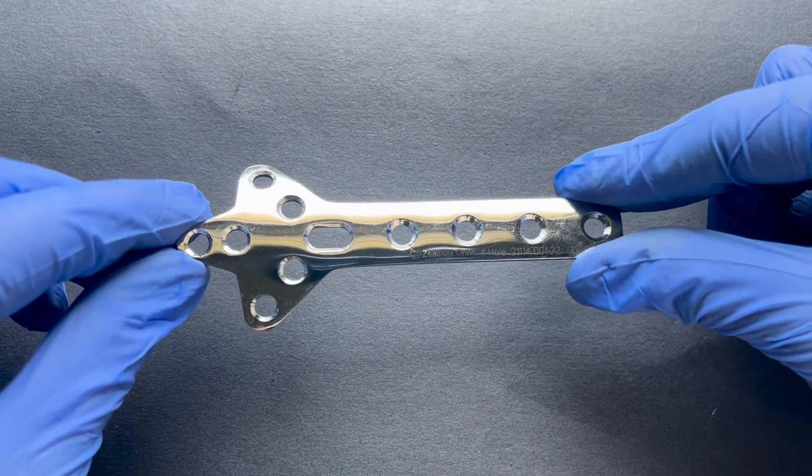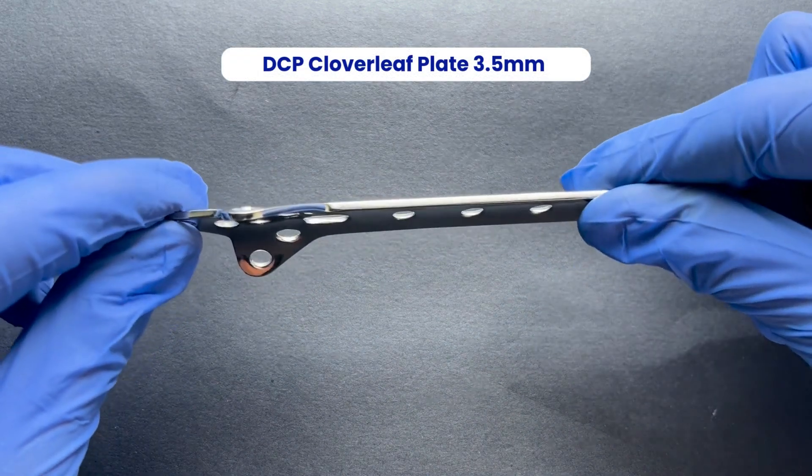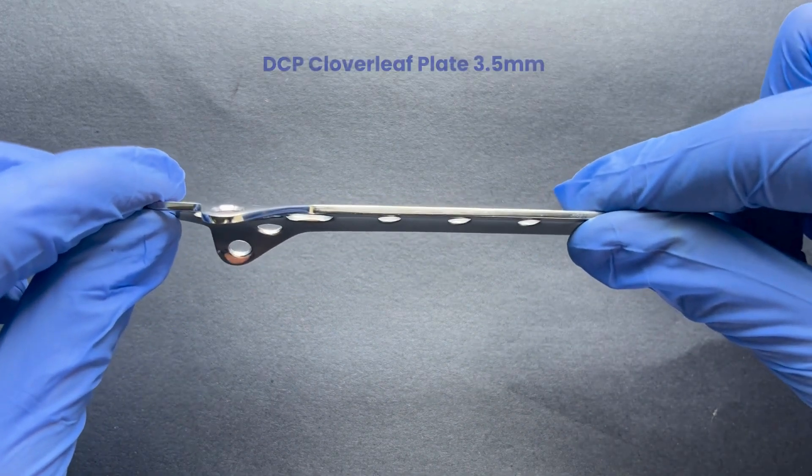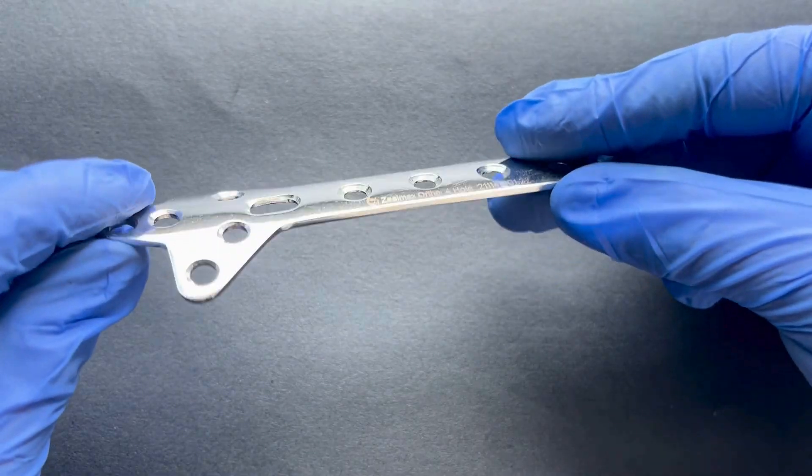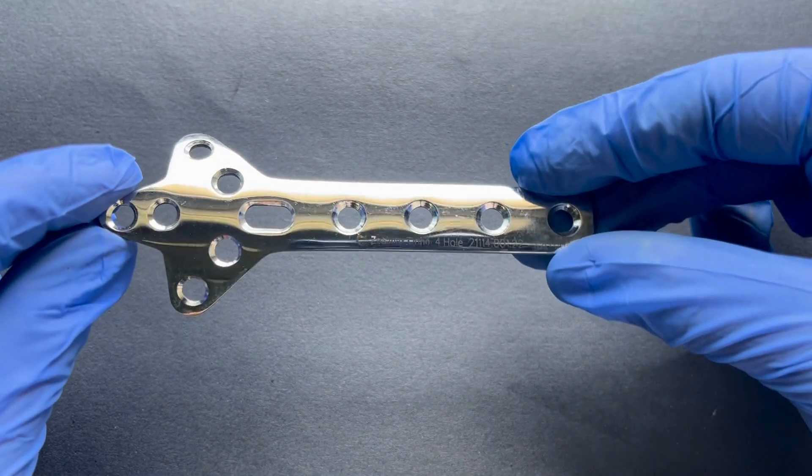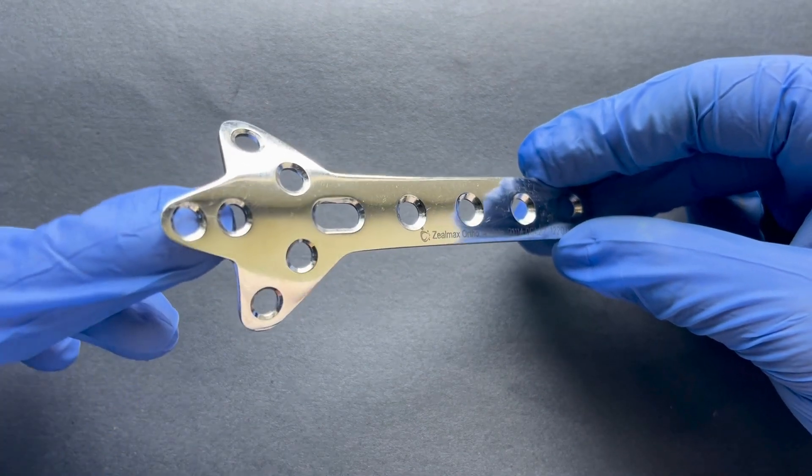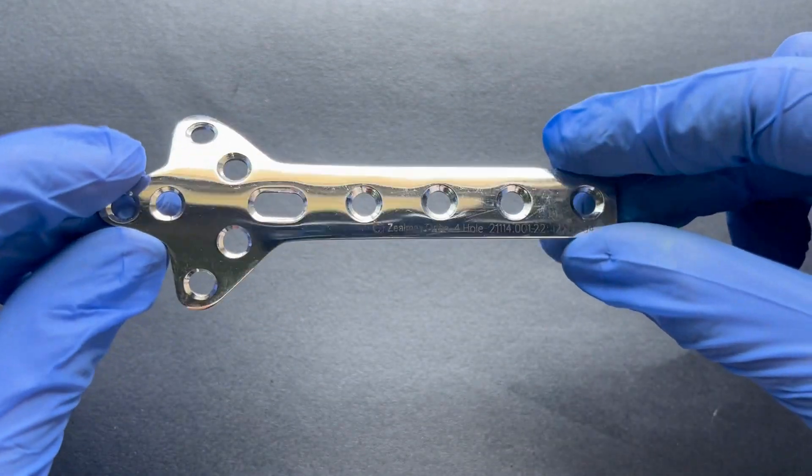Next up is the 3.5mm DCP cloverleaf plate. It is ideal for periarticular fractures, offering multidirectional fixation. Its cloverleaf design provides adaptable compression for precise fracture management.